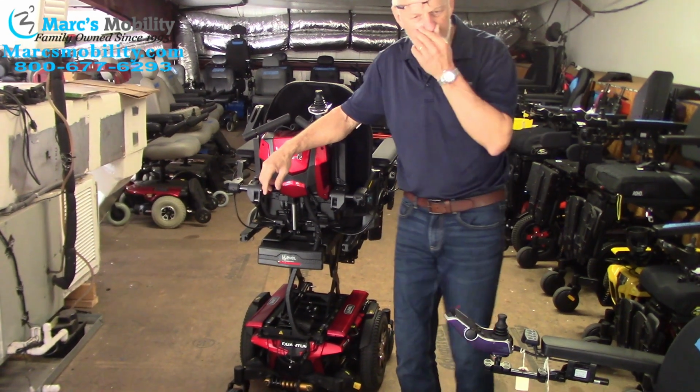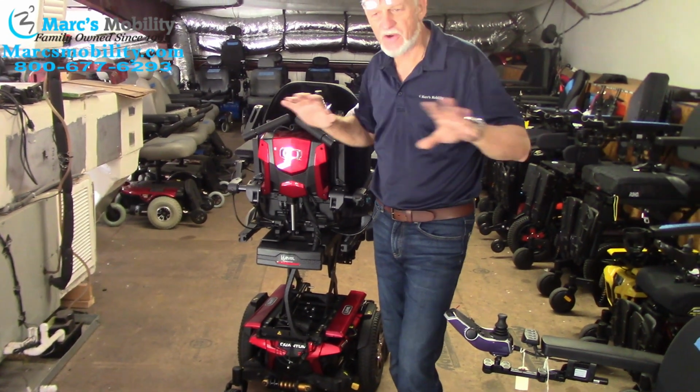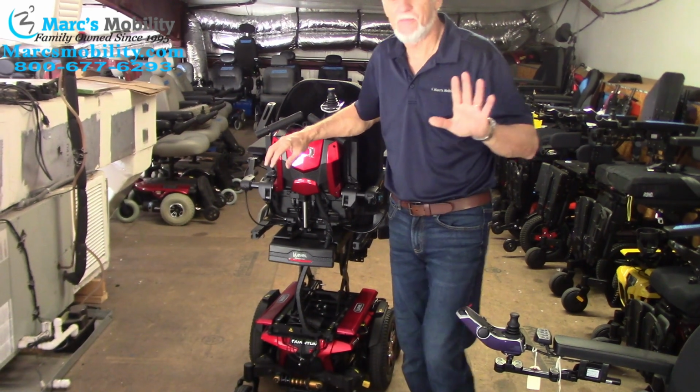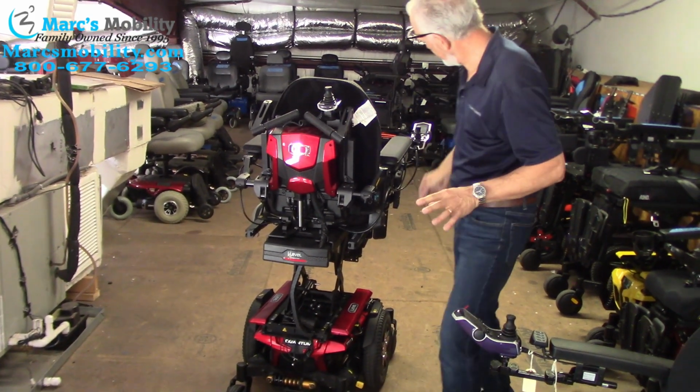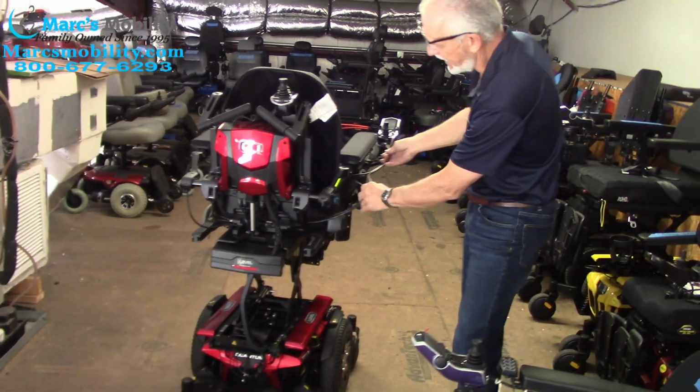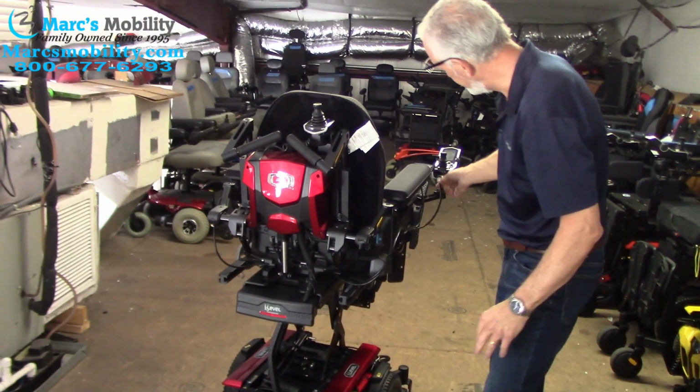Okay, so I'm using two different wheelchairs because your chair is set up between. Anyway, we're going to make it simple. The first thing you have to do is follow the cable from your joystick. Now this one has two cables here, but your joystick only has one cable that comes out.